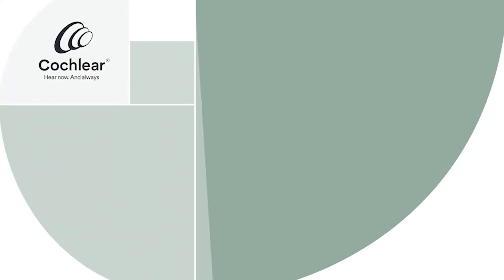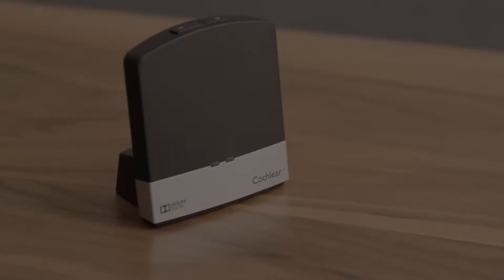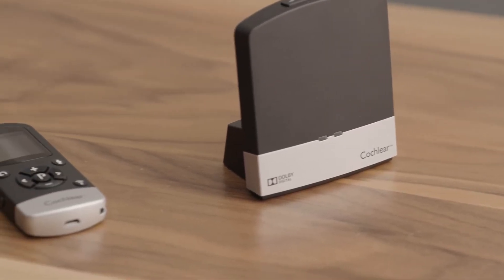Hi everyone, I'm Bethany, an audiologist and Cochlear employee. Today I'm excited to share with you what's included in the Cochlear Baja 6 Max sound processor kit. Whether you're a new recipient, have recently upgraded, or just curious to learn more, this video is perfect for you. Let's get started. As you can see, there's some great equipment that comes in the kit.